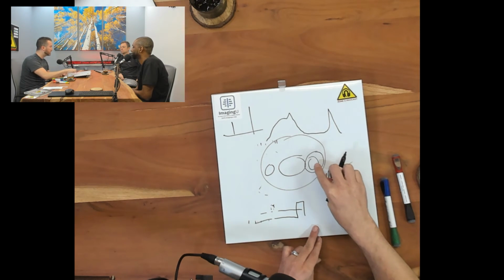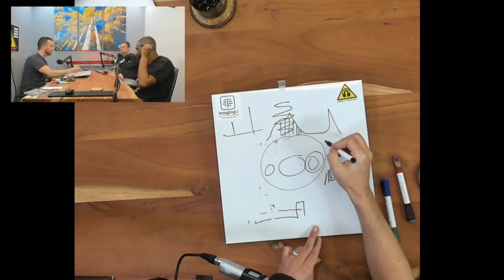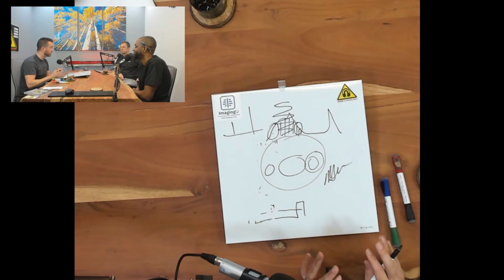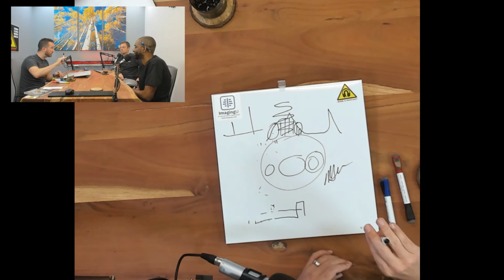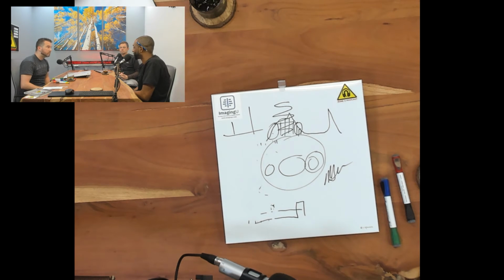But over here, outside of the center, an isocenter, these protons are spinning at all sorts of different frequencies, a really wide range. So we're only putting in our fat sat pulse here, and so you have really, really bad fat sat. This fat is unaffected, so you have bright fat. But inversion doesn't care about this at all. That's the reason it doesn't matter where my elbow is. It's still going to happen at the same rate. And that's the reason why inversion, I mean STIR in this case, is not sensitive to B0 inhomogeneities, not sensitive to the magnetic field having imperfections inside of it. Distortion and artifact, things like that.